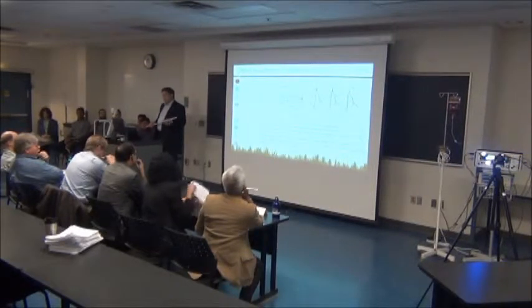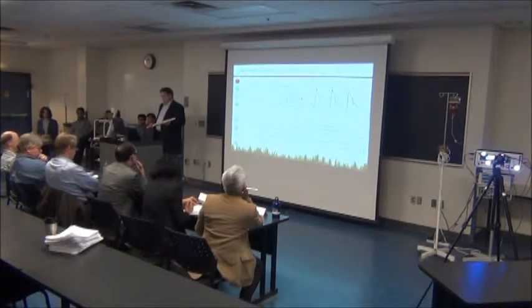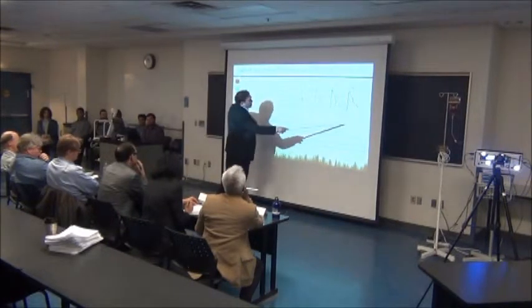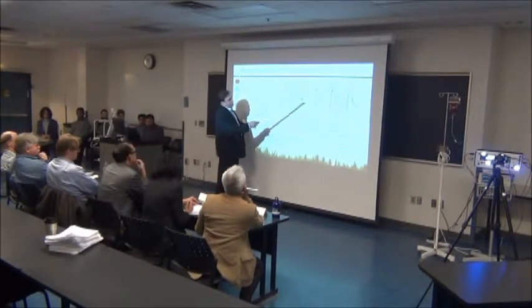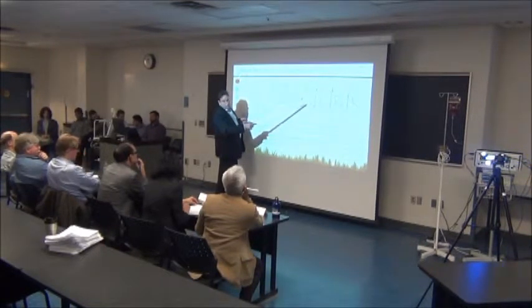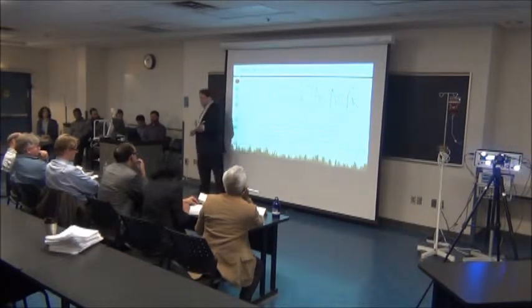We could then display this 800 millivolts on the monitor, labeling the y-axis as pressure instead of voltage. So if this is time and this is voltage, sort of like on an oscilloscope, we can just be tricky and change this axis to millimeters of mercury. So that's essentially what we're doing.